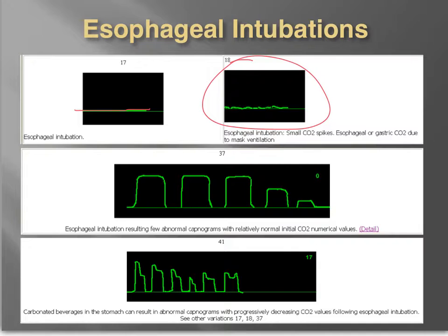When we're trying to learn something new, we can all have additional resources, and that's partly why I've been putting together these videos, to augment sites such as this. Looking down here, we can see esophageal intubation. We actually have a really nice waveform, but that waveform fades off after a while. I have personally never seen this, but where I think you might be more likely to see this is in the instance where you place a tube and somehow you manipulate the head or neck, and the tube slides out into the posterior pharynx slightly.